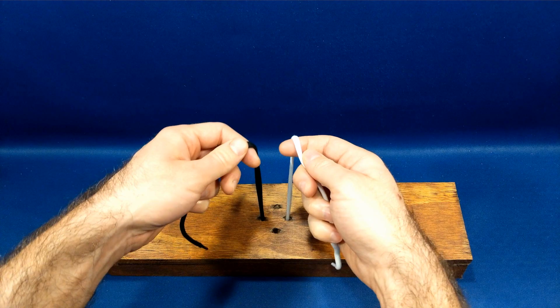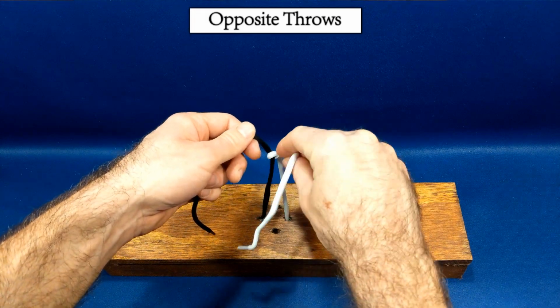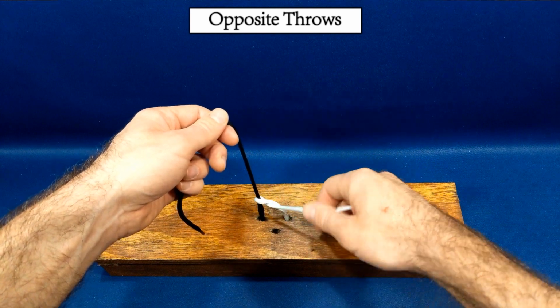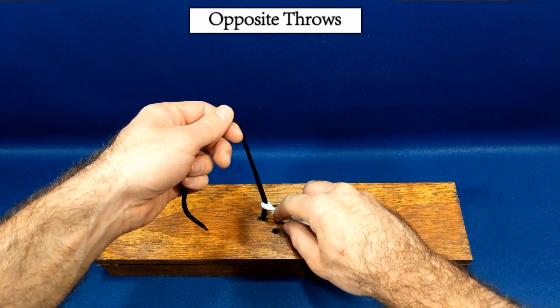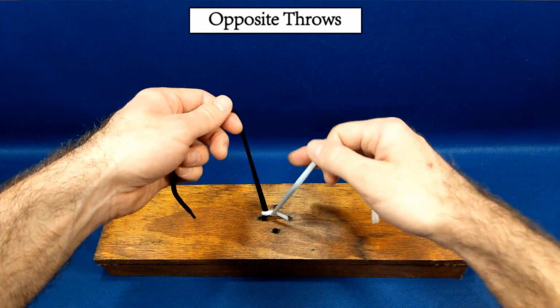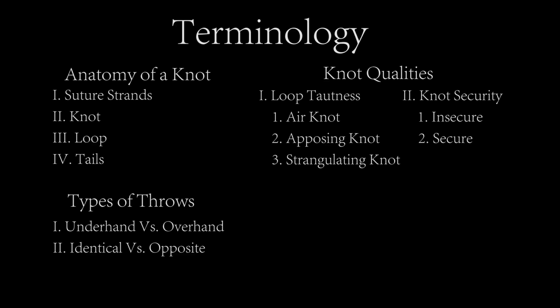Shown here is the performance of two opposite throws. An overhand throw is performed and then tightened, and then an underhand throw is performed and tightened. These two throws are opposite.